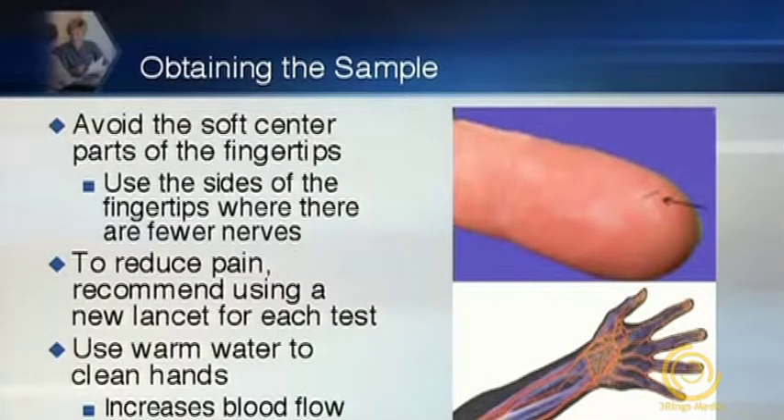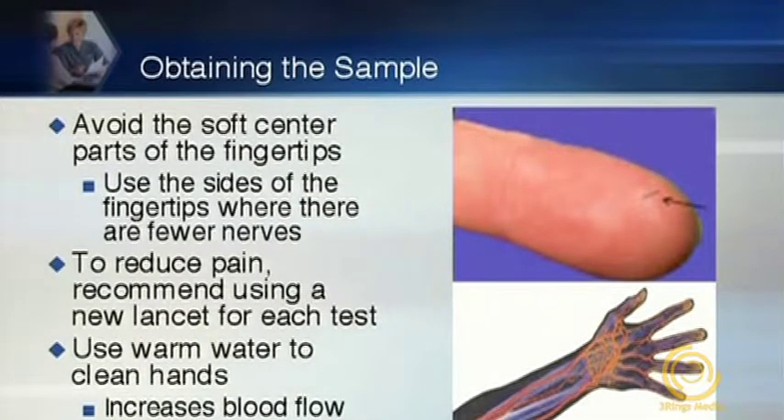Patients need to understand how to obtain a sample. We recommend avoiding the soft center parts of the fingertips. A tip I use in my clinic is to ask patients to put their hands together as if they're praying — the areas you can then see are the outer perimeters of the fingers, where you can prick. We're avoiding the soft center parts, where the deepest, most dense nerve endings are. Repeated puncture at those sites leads to increased pain. Also, to reduce pain, tell patients to change the lancet each and every time.